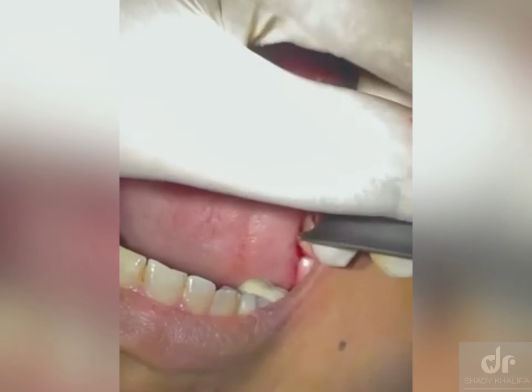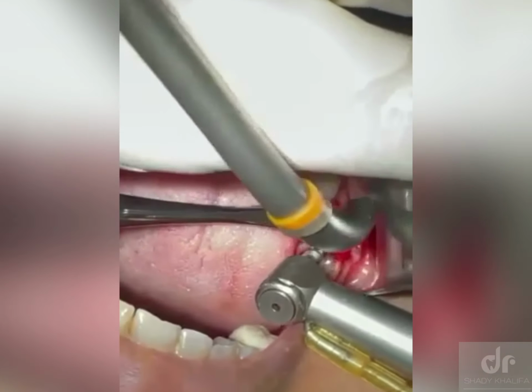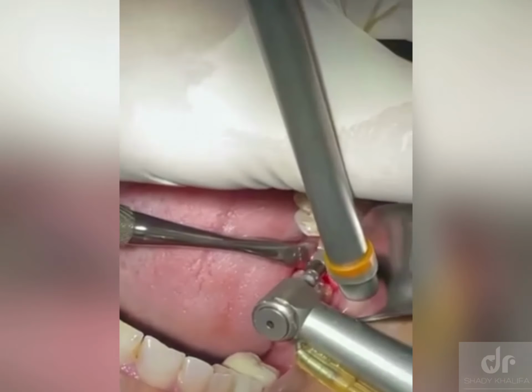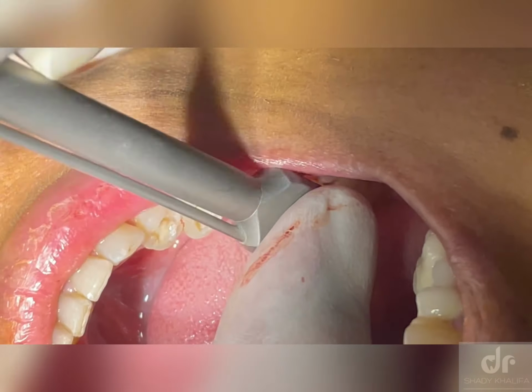It should be away and not contact the tissue, for the sterilization of the site. I start putting the implant by the handpiece until half or two-thirds, then continue manually, as we said.